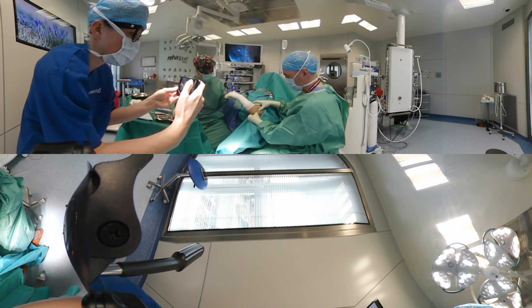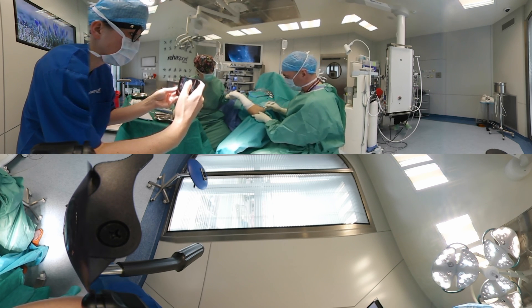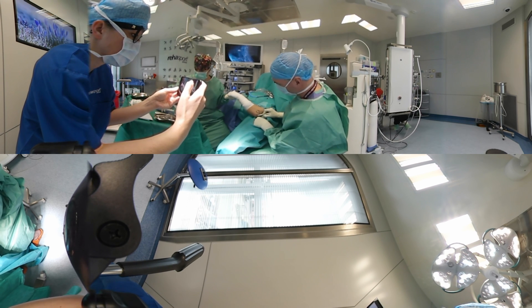This is a 360 video presentation of arthroscopic treatment of the tennis elbow. Before the procedure is started, anatomical landmarks are identified and outlined with a marker pen. That includes radial head, lateral epicondyle, and olecranon tip.